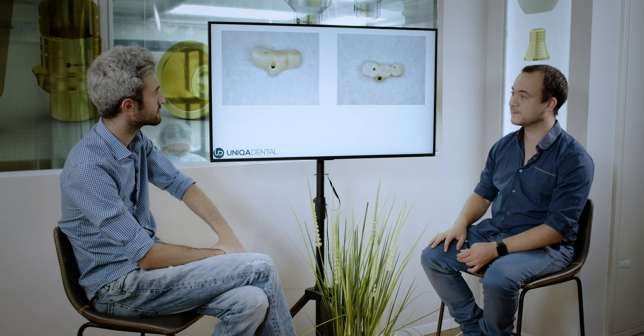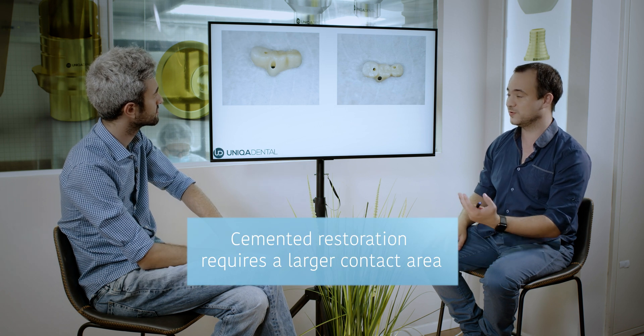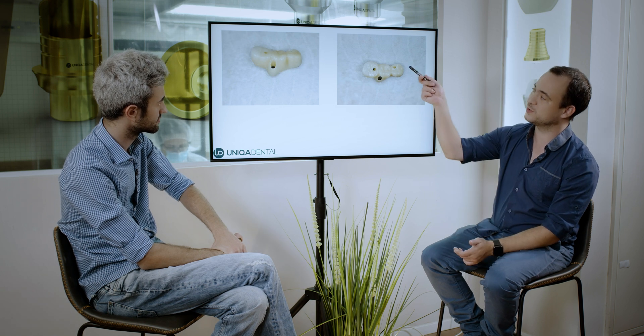For the cementation it's a problem. The higher the height of the abutment, the bigger the buccal bulge will be. So if you use a regular abutment, your bridge will be so deformed and uncomfortable. In this case, this implant was used with the smallest multi-unit possible and the smallest sleeve possible. The other two implants were with regular multi-units and regular sleeves.